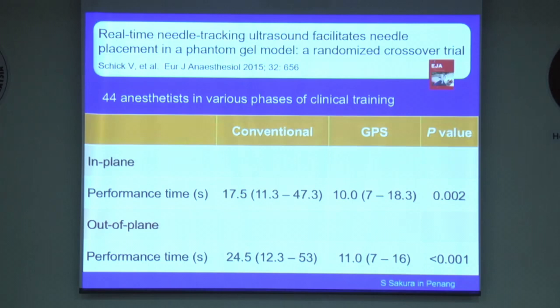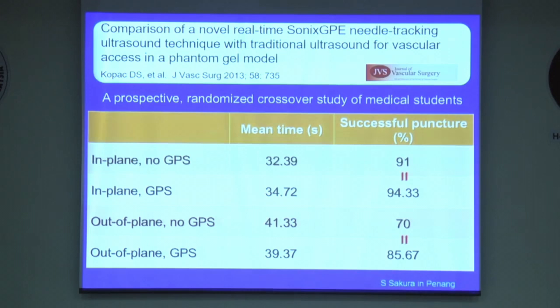So far, this technology is still in an experimental phase. Previous studies have shown mixed results. In this study, the use of this GPS needle tracking ultrasound system resulted in shorter performance time to place a needle in a phantom model. However, another study showed that this technology was not associated with higher success of vascular puncture compared with the traditional ultrasound guided technique. So we still need to wait for a while to see if this technology really helps us.